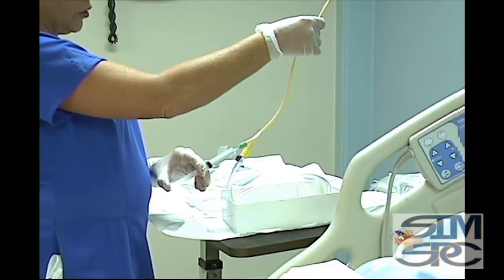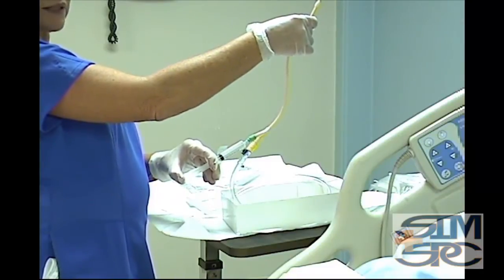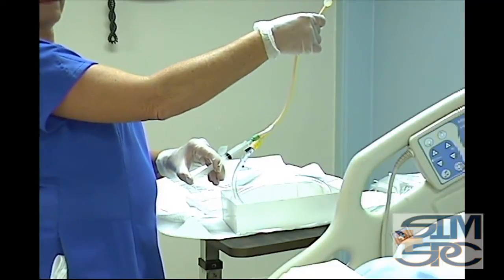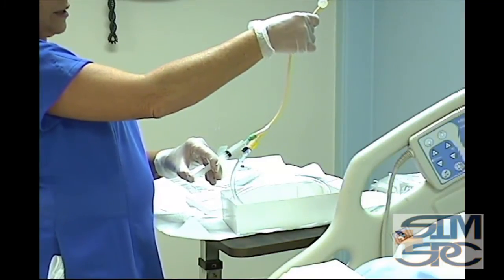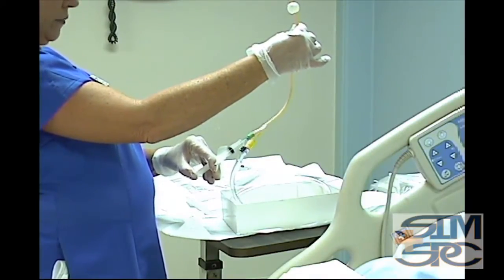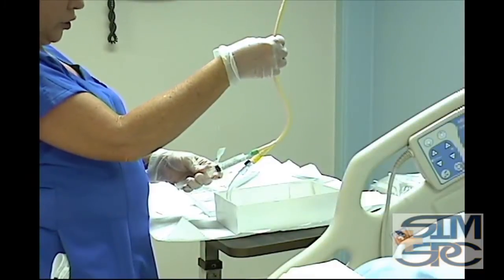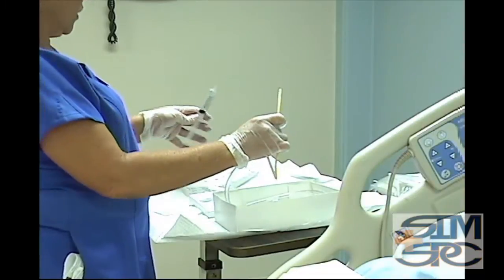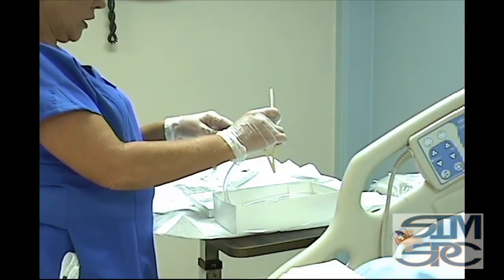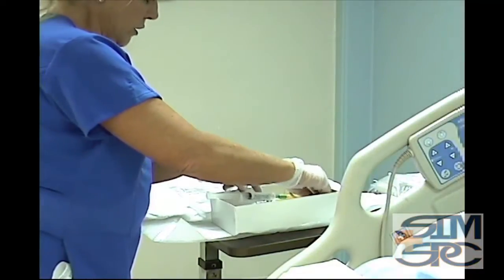There may be a time where we will not be doing this, as some hospital policies or particular companies have pre-tested these bulbs. So we're going to go ahead and check the balloon and see if it inflates without any leak. And there's not. So you can deflate that and take it back out. Okay, so I've just deflated the bulb. And now we're going to remove the excess air, and once you've done that, you can go ahead and attach. We're going to put everything back into the case of the tray.